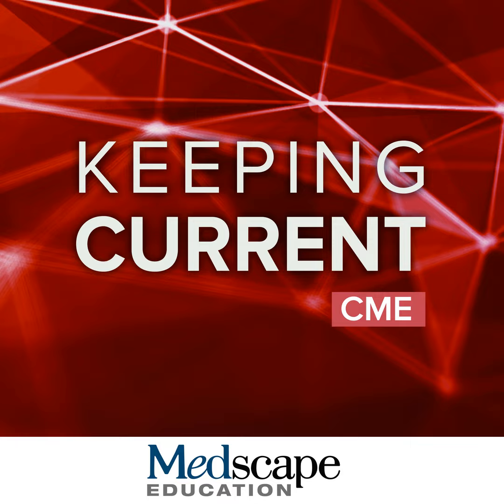We also need to be sure to talk about these baseline features of microhemorrhages and siderosis. So these are features we know of as cerebral amyloid angiopathy. People are at increased risk for developing adverse events during their therapy if they have these on the baseline. So you need to make sure that you collect the right scans at baseline and that you report this out at baseline very carefully.